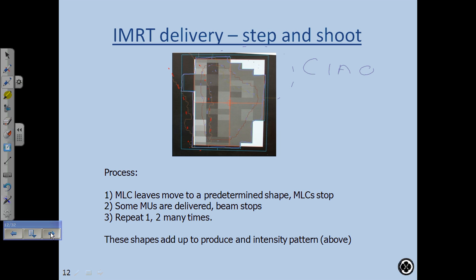That's in one of the documents that I put up there. What it is, it's the most extended opening of the field. It's what you're going to treat through. So anything outside of that is going to get no dose, and anything inside of that is going to get a fluence-modulated dose.